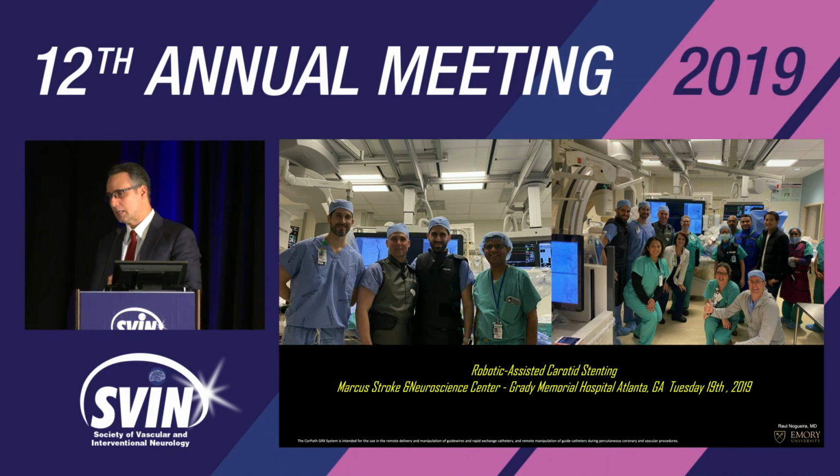And the time of procedure? For the first few cases, you're going to increase the duration of the procedure. There will be a learning curve. There is a lot of loading and unloading of things in the system, but I think over time you're going to conquer this, feel more comfortable with it, and you're going to have the advantages of no radiation exposure, no lead apron upon you, and I really think this is going to be a very promising technology.